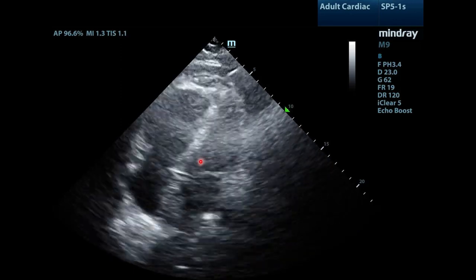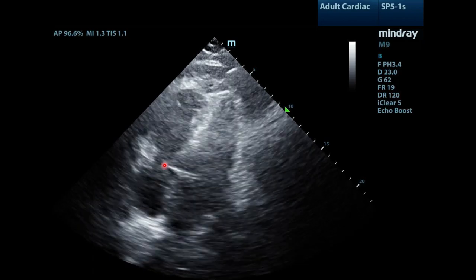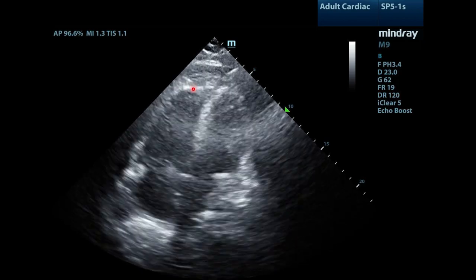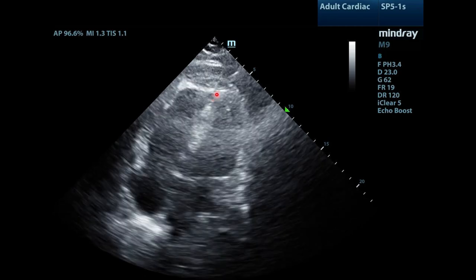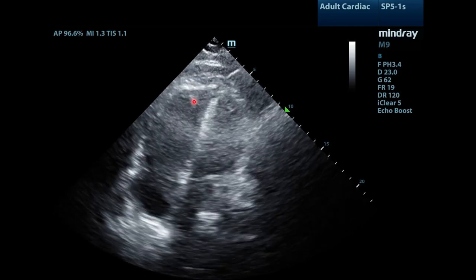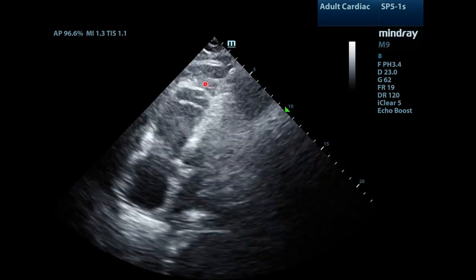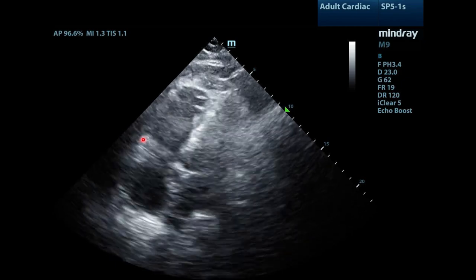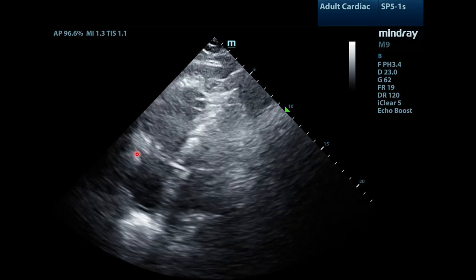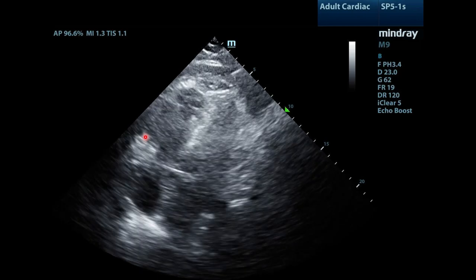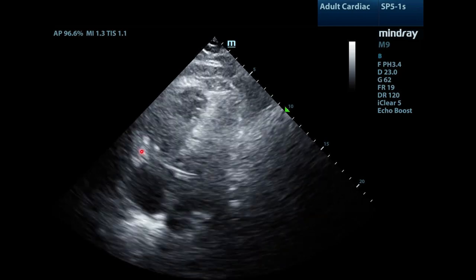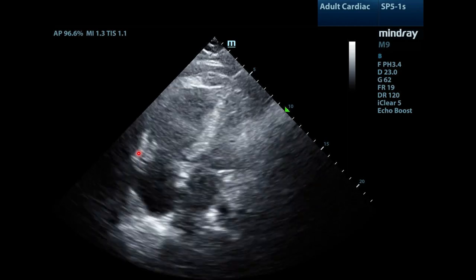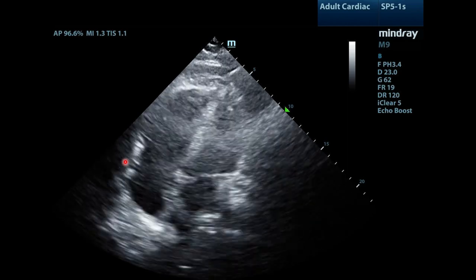Moving to the apical four chamber view, notice that the RV is still large, but the most prominent feature is what we call the apical wink. It's a hypercontractile RV apex that looks like it's winking at you. The free wall of the RV is not moving as well as expected, which is also known as the TAPSE — that is depressed. This is consistent with McConnell's sign, the combination of these two findings.